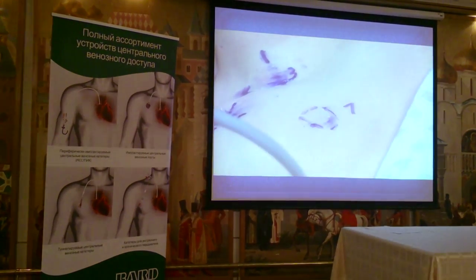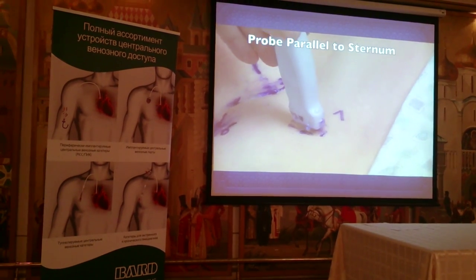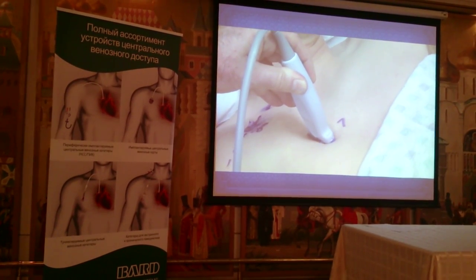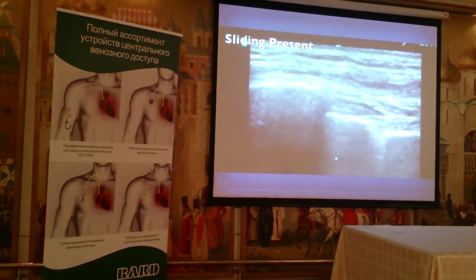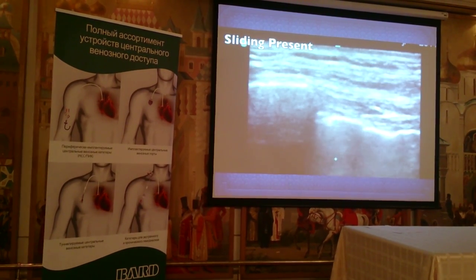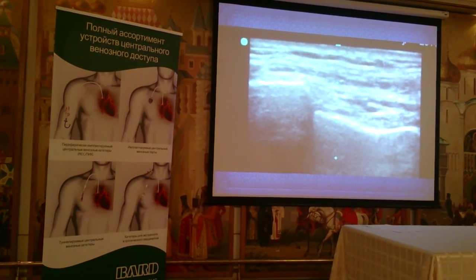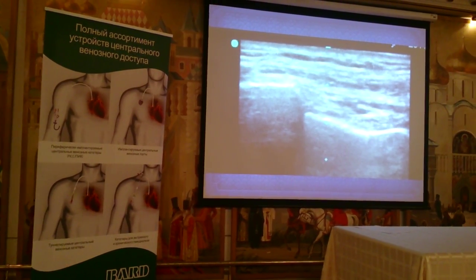For position number seven, we take the ultrasound probe and place it parallel to the sternum in the upper chest. We look for the sliding lung sign, which demonstrates normal pleural dynamics — particularly confirming that you have not caused a pneumothorax during the procedure. We prefer to assess this both before and after the procedure. We can see a nice sliding sign. This completes the seven-point evaluation that helps us determine the best veins for central venous access.